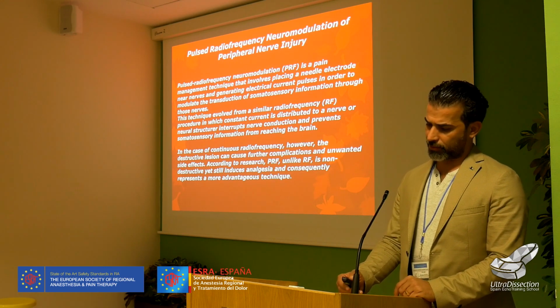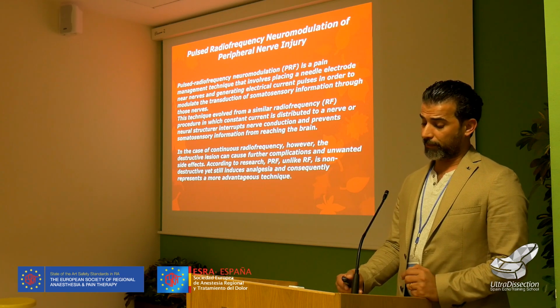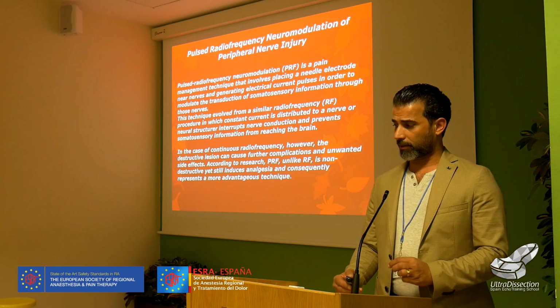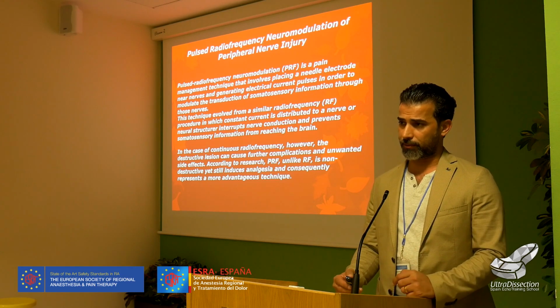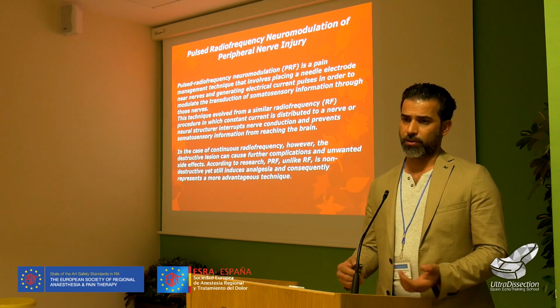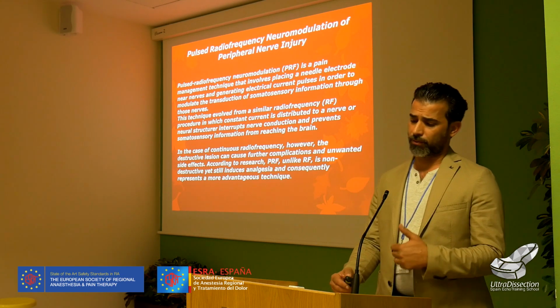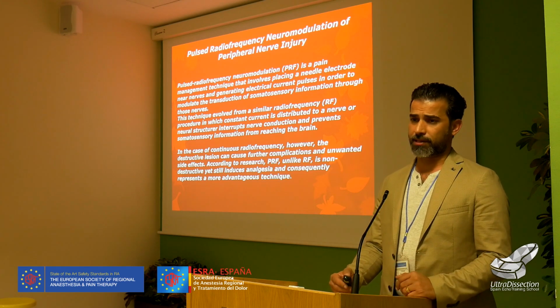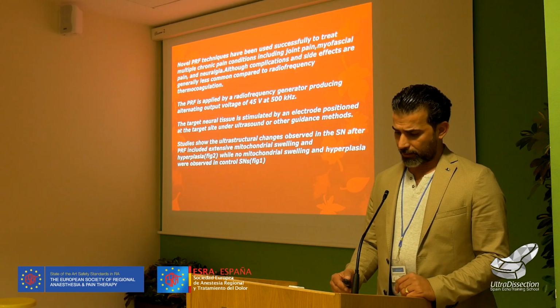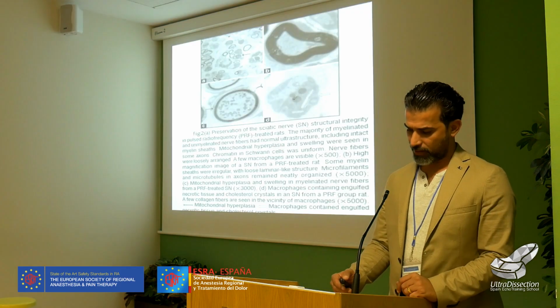And also here is the pulse radiofrequency neuromodulation of peripheral nerve injury, and the combination of pulse radiofrequency. You know that a traumatized nerve patient complains of pain, allodynia, cramps, many types of chronic pain. So here we need general neuromodulation, electrical stimulation plus pulse radiofrequency, to modulate the physiological changes of the nerve, and hydrodissection for the mechanical decompression of the scarring and adhesions. I will open the videos before these details, because these details are very deep.